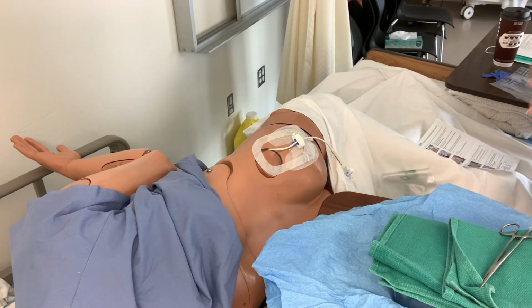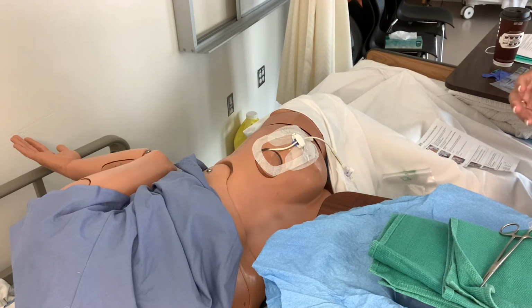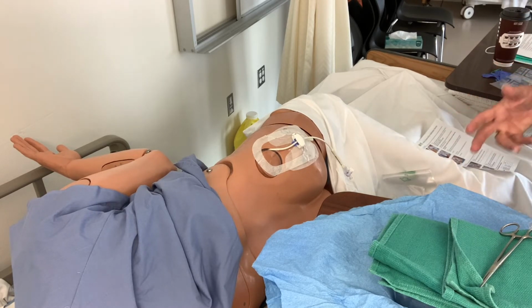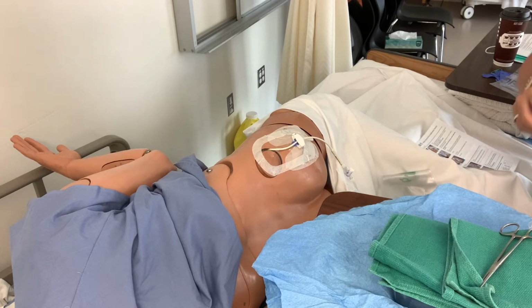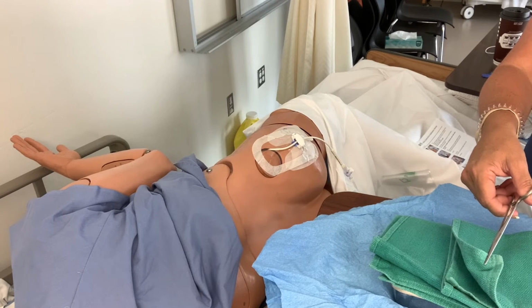So I'm set up here so I can shorten the video, but okay, I have the patient turned to the side. Again, I'm going to open the system, so I will wear a mask, the nurse, and the patient will wear a mask as well. If they are unable to tolerate it, they have to turn their head away. Again, we are opening the system, so we need to be aseptic. So what I'm going to do is pick up, I'm just barehanded at this point, the sterile towel.